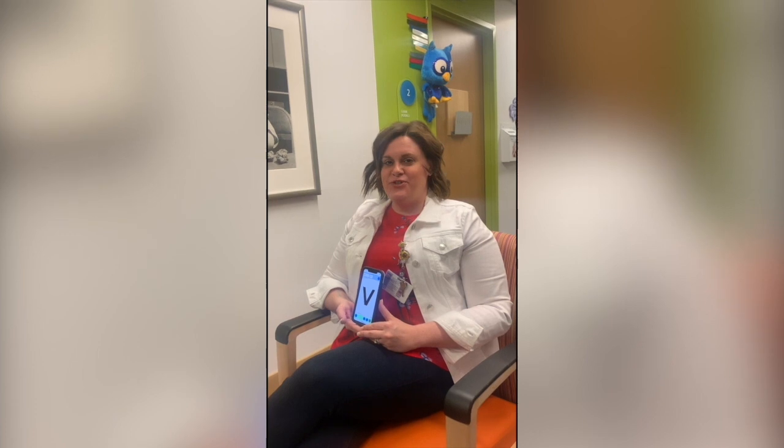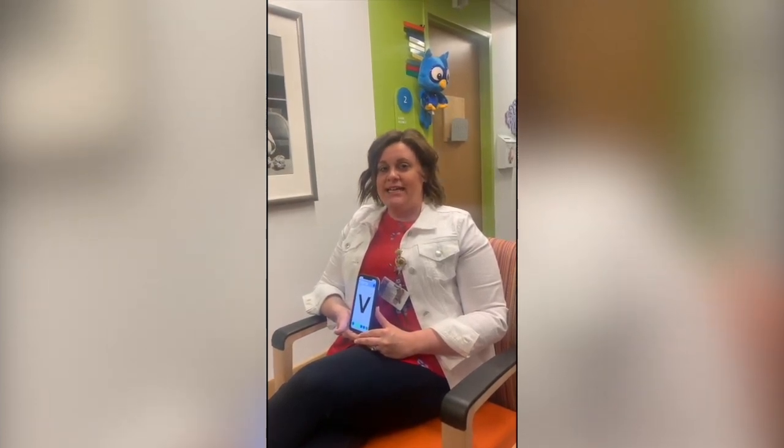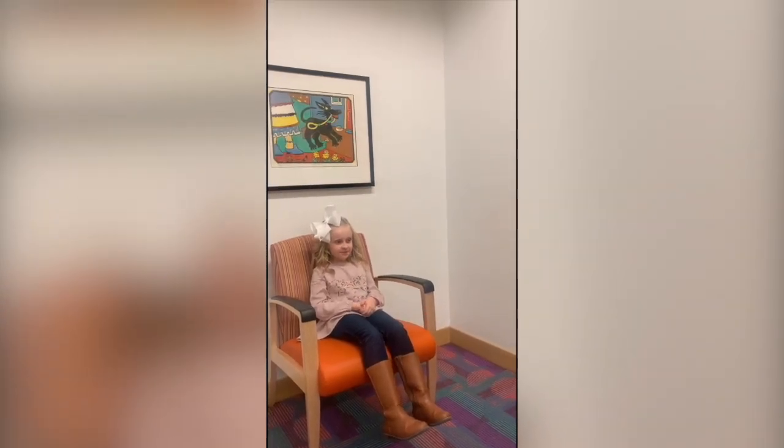When testing your child's visual acuity, you want to be 10 feet back from the child and have your phone at eyesight level.